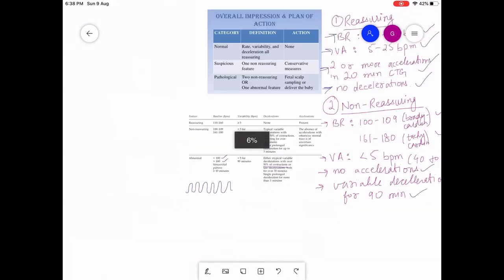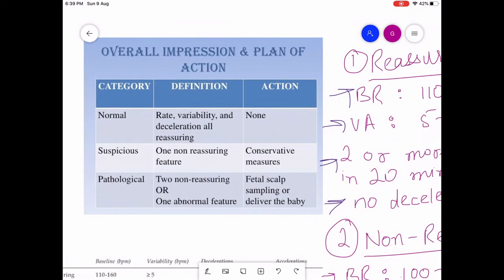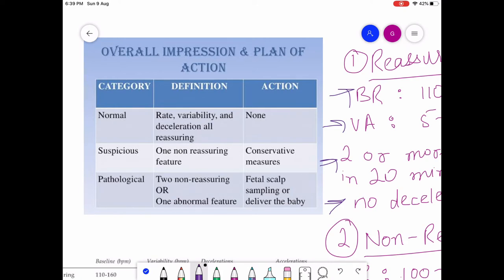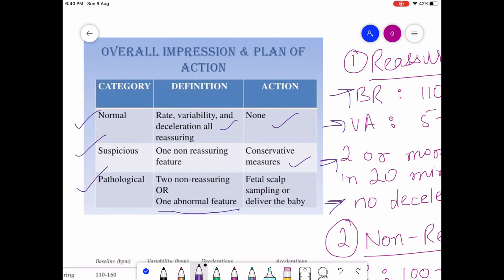The overall impression categorizes the CTG as normal, suspicious, or pathological. Normal means all features are reassuring — no action needed. Suspicious means one non-reassuring feature is present — take conservative measures. Pathological means two non-reassuring features or one abnormal feature — action required, either fetal scalp sampling or delivery of the baby.